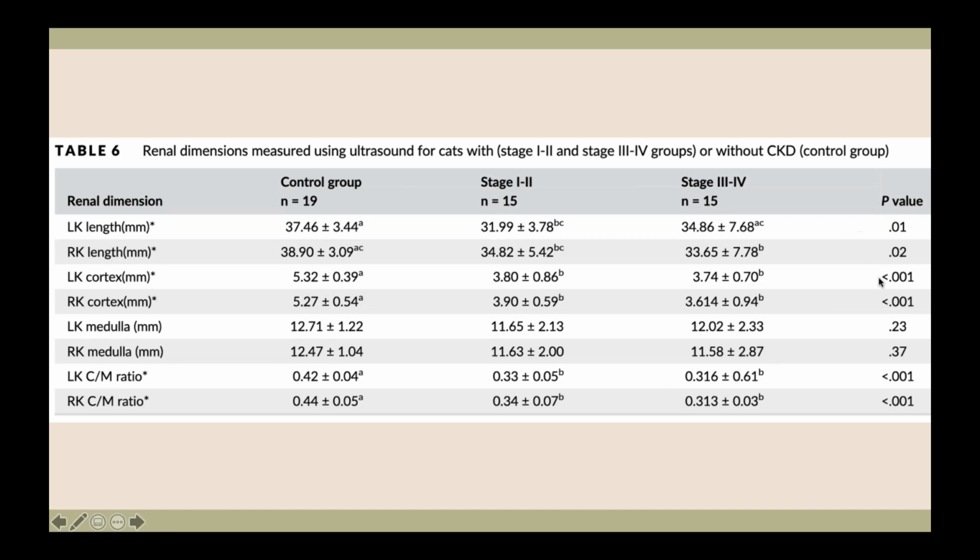You can see that certainly there were statistical differences that were there. I frankly just don't take a lot from it when we really start separating one kidney from the next. I'm not going to use a single kidney that performs better statistically as how I'm going to diagnose CKD in my patients.